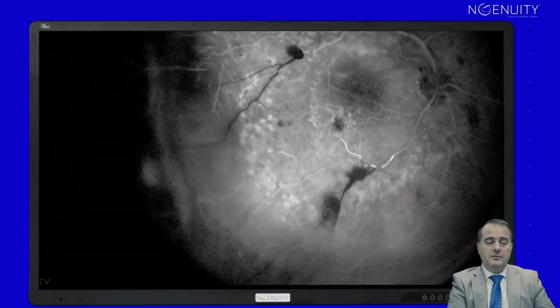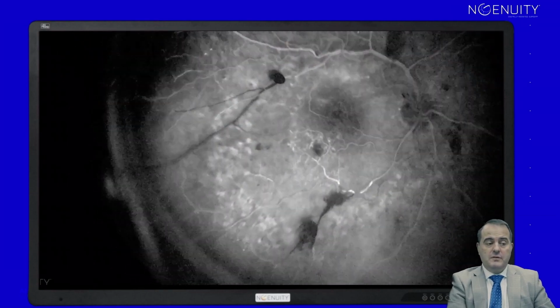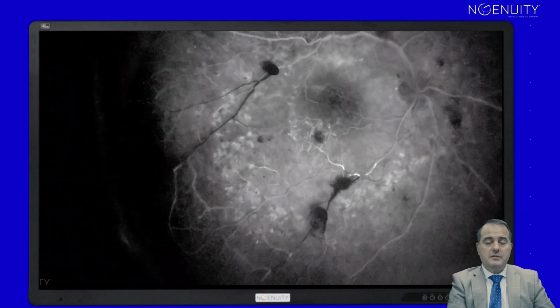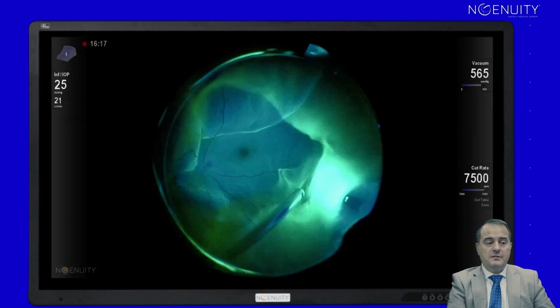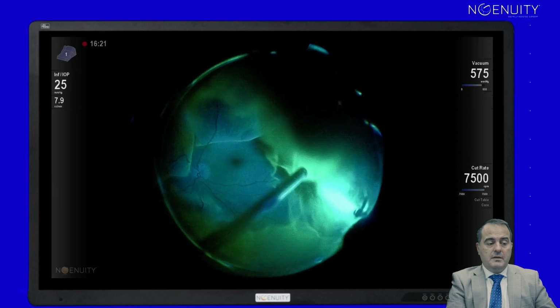This is intraoperative. After the indentation, which is a physical maneuver, we see a reperfusion of the congested vein. So these are phenomena which we not normally look for or see during a surgery. This is another thing which is absolutely new.